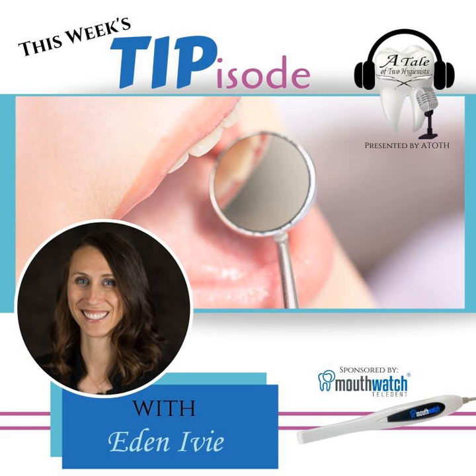Hygienists have a very clinical knowledge base and a clinical vocabulary that our patients don't have. And sometimes we have communication issues and a little bit of a language barrier. An intraoral camera breaks down that barrier. If you can show a picture of your patient's tissue, some inflammation, they're going to see that red, boggy, bleeding tissue, and they're going to understand that there's an infection there. With that picture, we're able to convey the true status of their oral health without using a bunch of jargon that they're not going to understand.